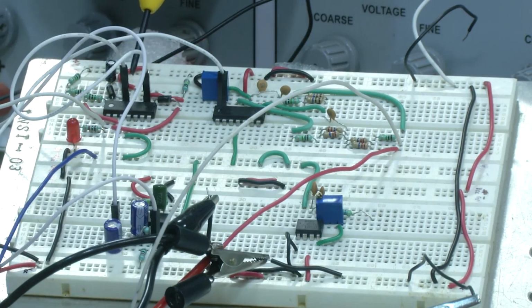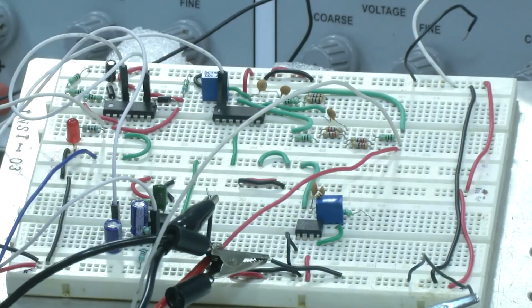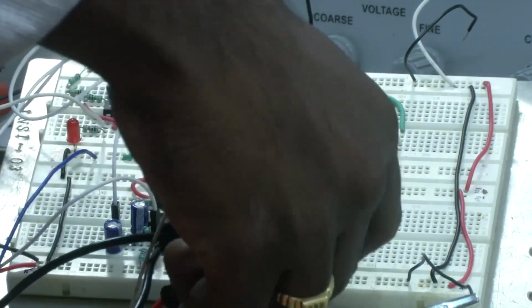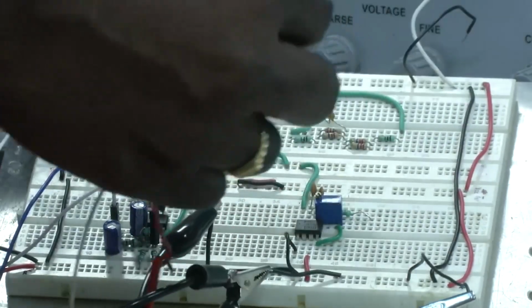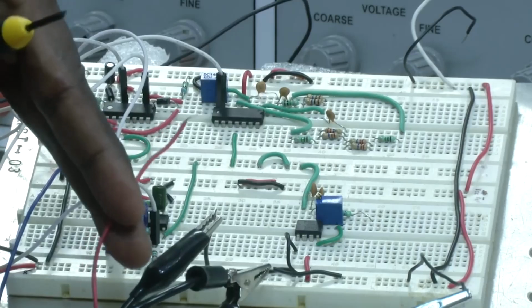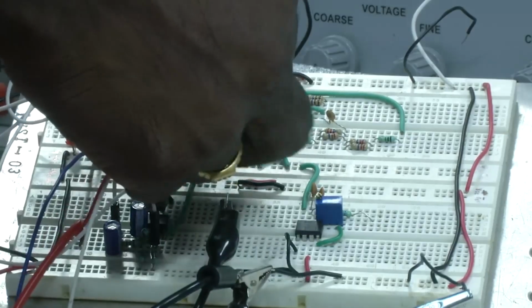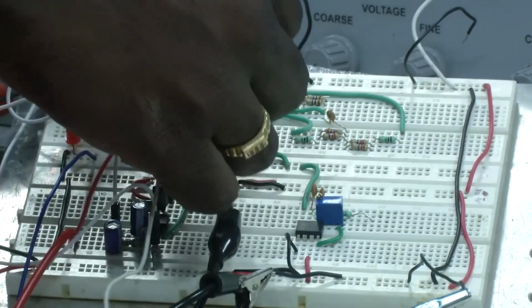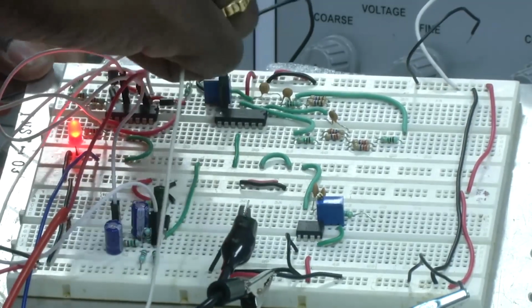This is the diode and the first quadrant portion of the op amp, which is the half wave rectifier portion. So in order to verify that circuit, the input signal we will connect to the input of the operational amplifier, that is at pin number 3. So I will take the input sinusoidal signal of 3 volts to the third pin. The third pin is somewhere here, okay, and this is the output.